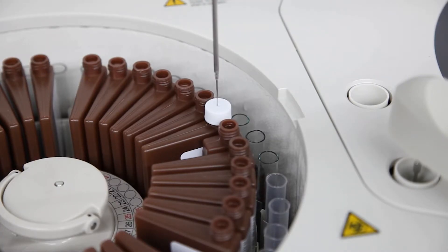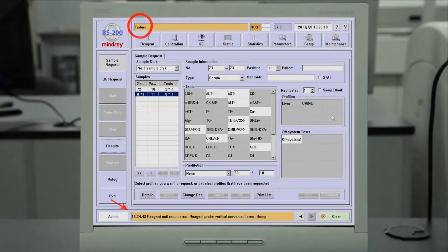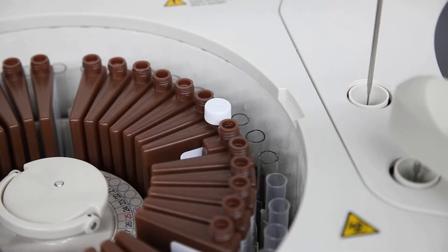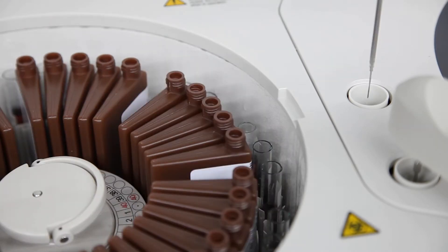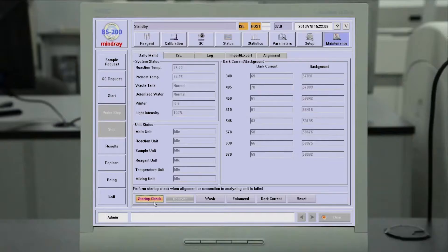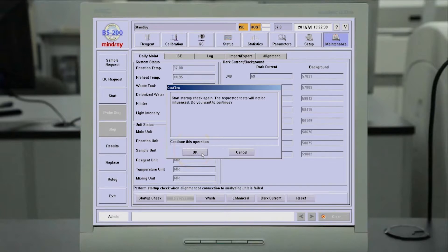Should a probe collision ever happen, the analyzer gives an alarm and stops after trying three times. The operator simply removes the obstruction or resets the instrument with a simple one-touch recovery button.